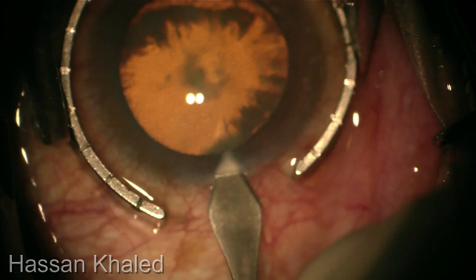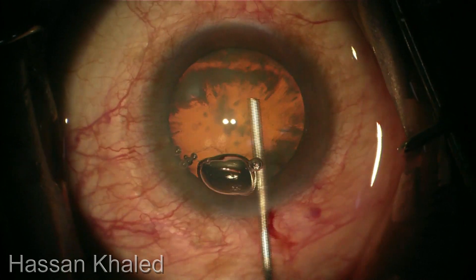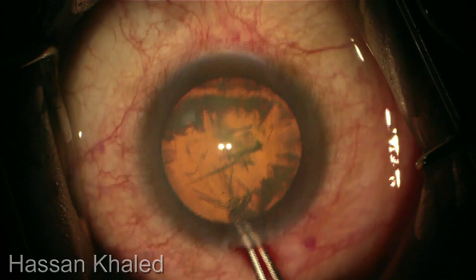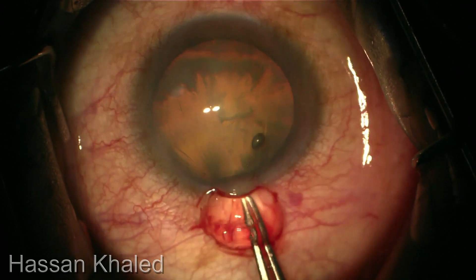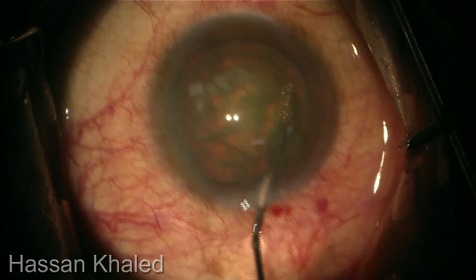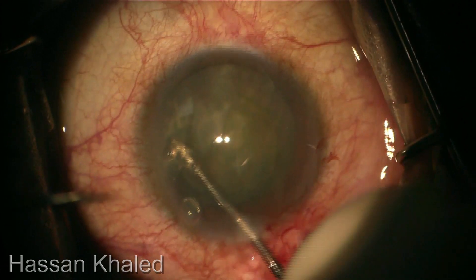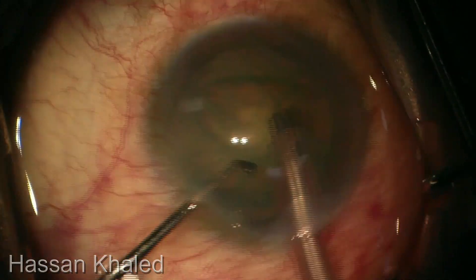I started my surgery with a 2.2 mm clear corneal incision, then injecting dispersive OVD, which is very important to protect the endothelium of the cornea. Then I did the capsulorhexis — a beautiful capsulorhexis, about 5.5 millimeters, well-centered. Then I slightly emptied the anterior chamber from the viscoelastic. You can see a beautiful wave during the hydrodissection. Injecting dispersive again and rotating the nucleus to confirm that the hydrodissection is complete.